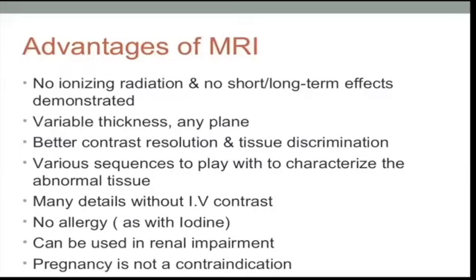Here we need to know what the advantages of an MRI are. Notice that whenever we were speaking of CTs and X-rays, both were relying on X-ray technology, which means that both were relying on ionizing radiation. Now, MRI does not rely on ionizing radiation, so that's why we're not really concerned about pregnant patients or about the radiation effects.